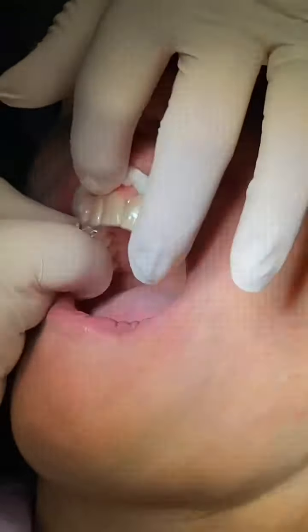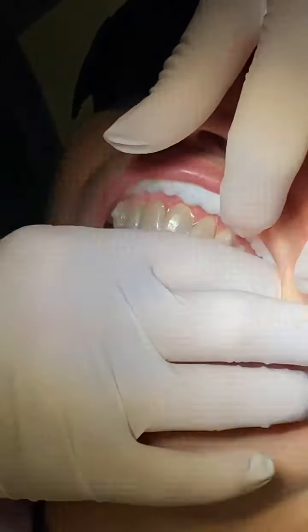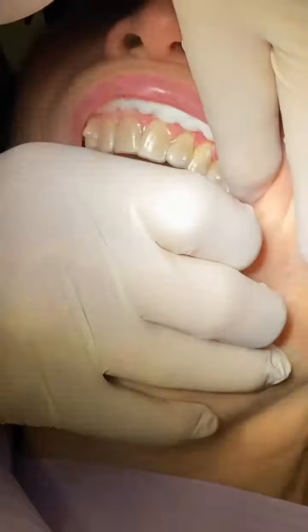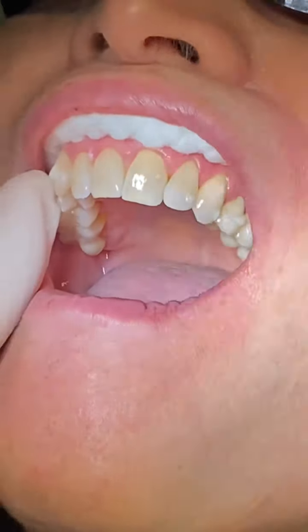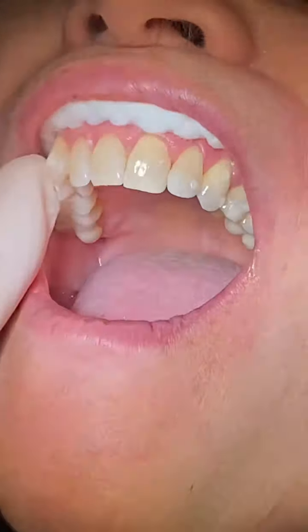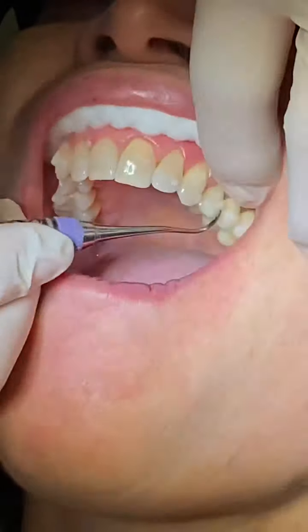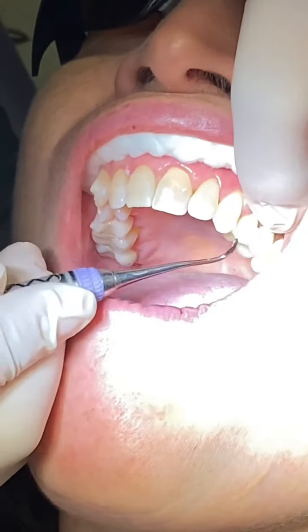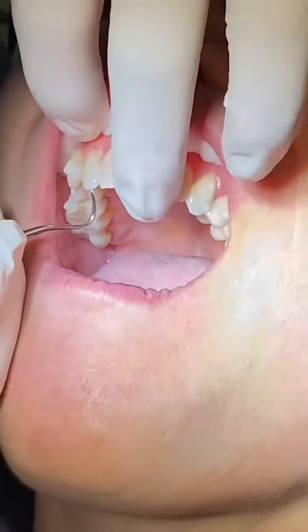The moment of truth — the template comes off and the attachments are in place. As usual, there is very, very little work to do at this point. The material stayed exactly where you wanted it. We double-check to make sure there's no excess, and all we need is an instrument in the area just to check — we don't have to pick up a handpiece to remove any excess.